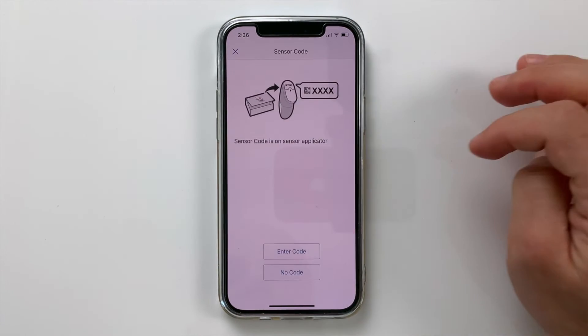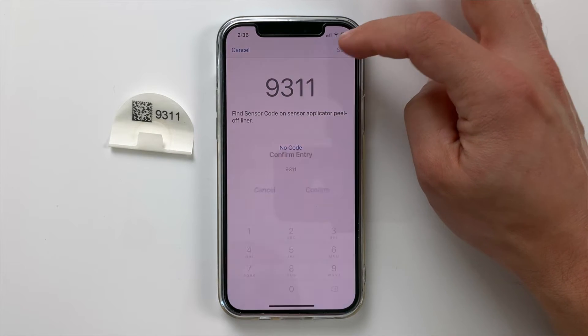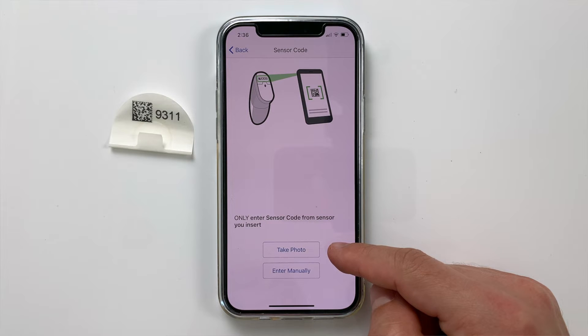Now that we've applied the sensor, we need to start it in the Dexcom G6 app. Click 'New Sensor' and enter the four-digit sensor code from the sensor you just applied. Some people say you should avoid using two sensors with the exact same four-digit code because this might mess up the system. If you have another sensor with a different code, try to use it in between. If you only have sensors with the same code, make sure there is a long enough break before applying the new one so the system doesn't think you're trying to extend the same sensor beyond 10 days. You can also scan the sensor code instead of entering it manually — pretty cool.